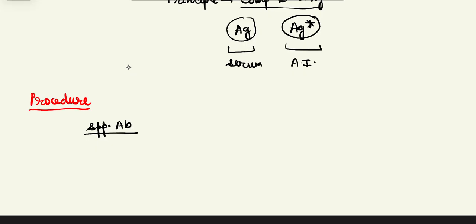because right now what we need to do is, again, let us say, determine the concentration of one antigen X. Now let this antigen this time be a hormone. So we have to detect the presence of that particular hormone which is acting as the antigen. I can write it as, let's say, H only. H stands for the hormone antigen. So this is my hormone antigen.